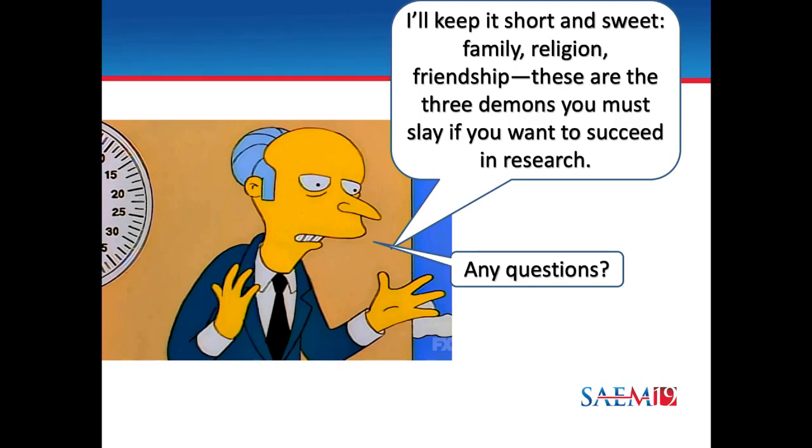So we looked between the two users on the same set of people, how often you got 18 out of 18 checks, 15 out of 18 checks. And what we found was about 10 to 12% of patients, it just is not going to work. Whether it's because they're too tachycardic or their windows are just too difficult, that's your base rate. If you talk about your acute heart failure population, in reality, probably more like 12 to 15%, they're out. But the rest of them, in our studies, we've only had to really toss about 10 to 15% of patients because of an inability to do the data analysis, which is about half of it is quality.